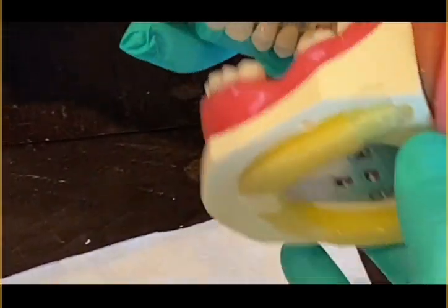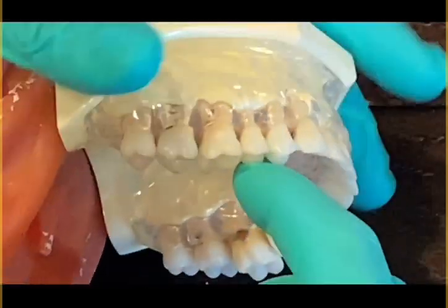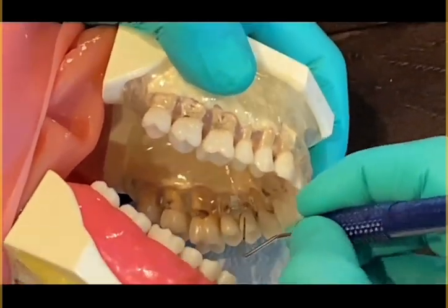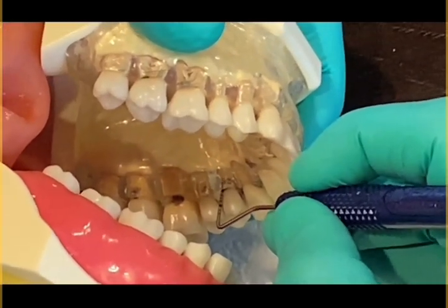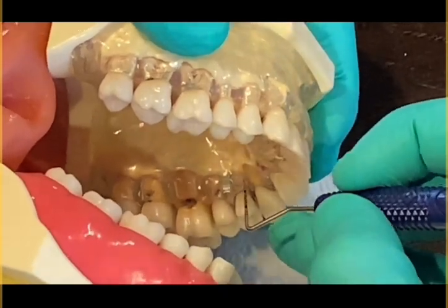Coming back around on the lingual. Goes back to the other order. We're on number 12 here. 4. 5. I think I missed one.